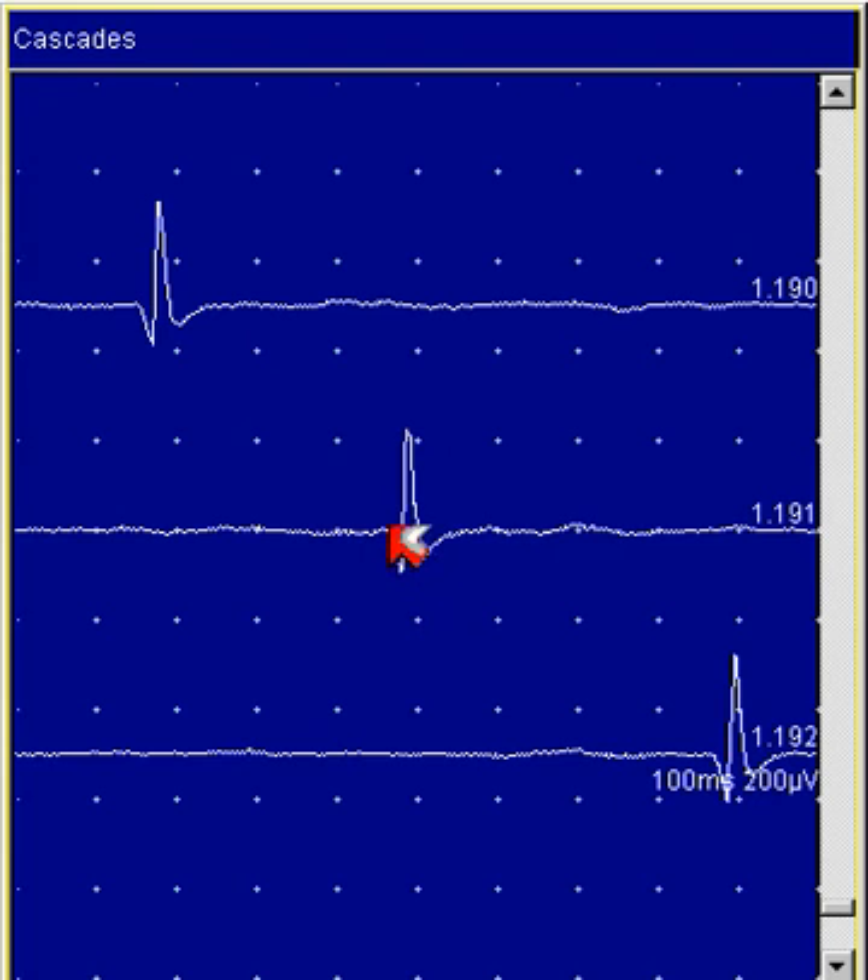It has three phases. The initial phase is downward going, then the negative phase, and the terminal low-amplitude positive phase. This phase was difficult to see on the free-running EMG display, so one may estimate the number of phases to be two or three.